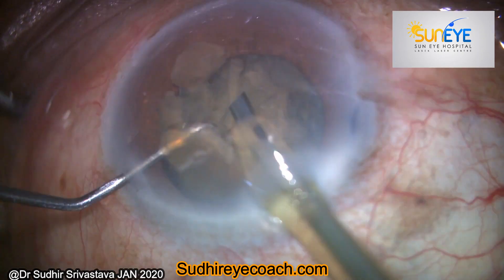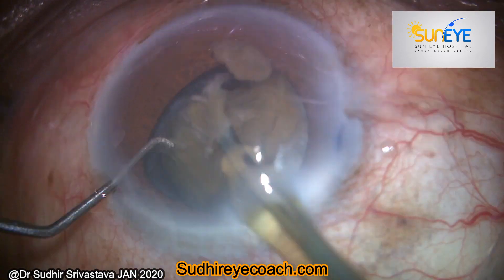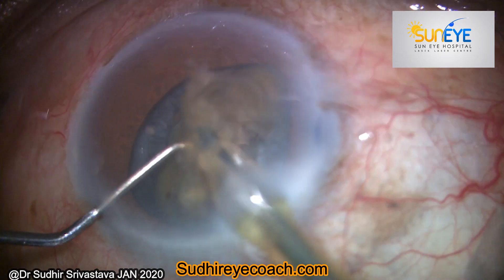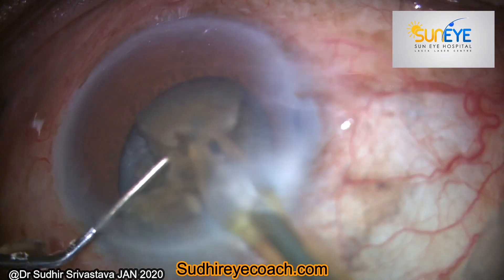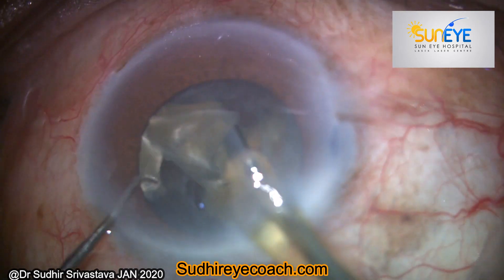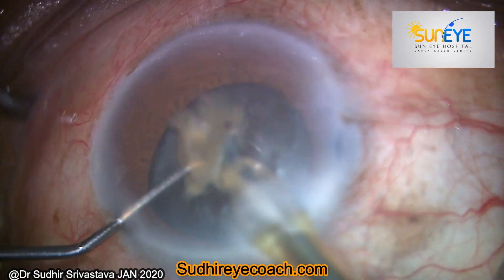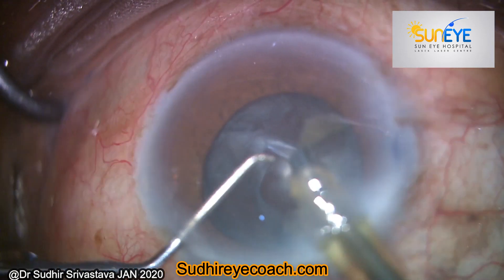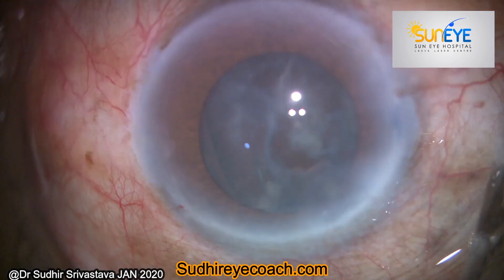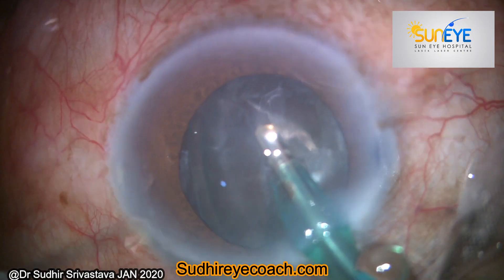Whenever you feel your side port incision is leaking, you can stop the surgery, hydrate that particular wound, and create another side port incision. Through the new second side port incision, I finished my phaco fragmentation safely without any chamber collapse and any complications.